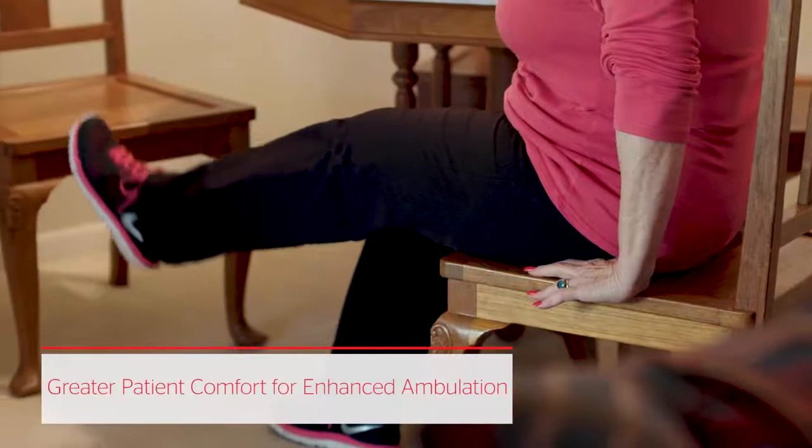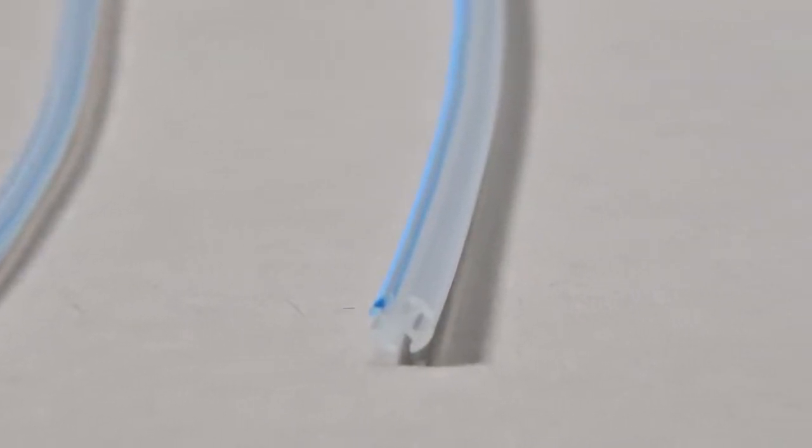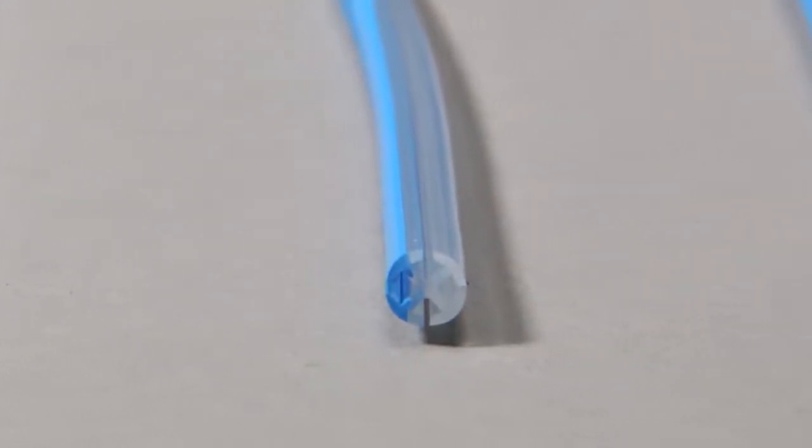Because early mobility is key to a speedy recovery, the smaller, more flexible Blake drain is designed for greater patient comfort and greater ease of mobility. Patients also experience less discomfort upon removal of Blake drains.